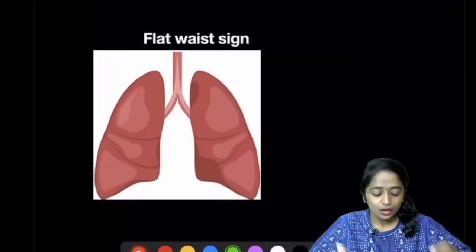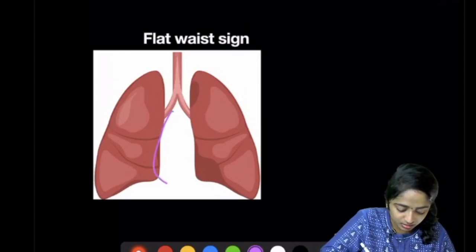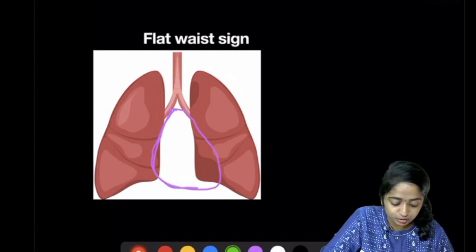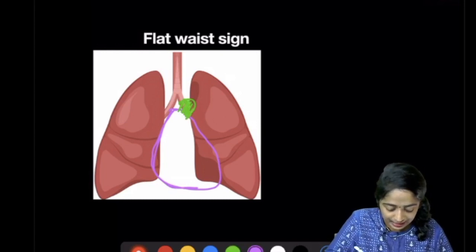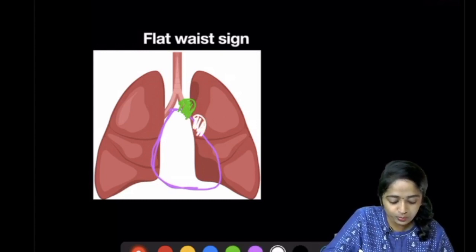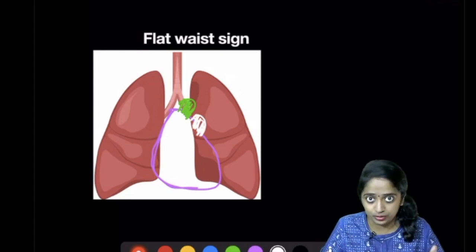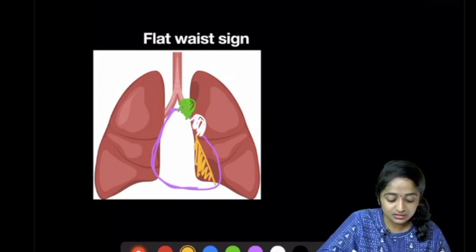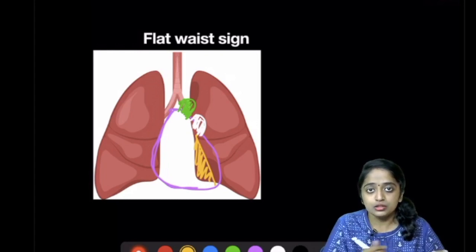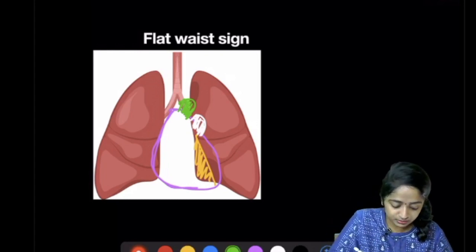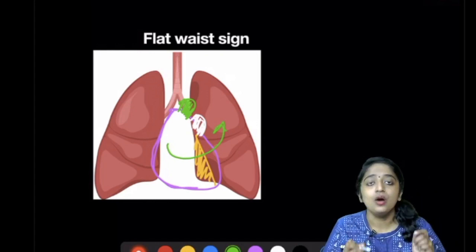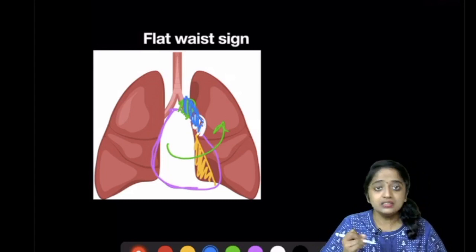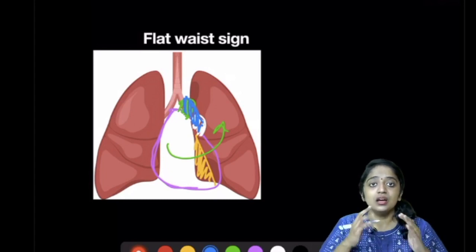Coming to the flat waist sign: on a normal chest radiograph, you get two prominences — the aortic knuckle and the pulmonary bay. In left lower lobe collapse, you get a retrocardiac triangular density, and there is a pull of the mediastinum. Due to this rotation, the aortic knuckle and pulmonary bay also rotate and lose their knob-like prominence on the chest radiograph.